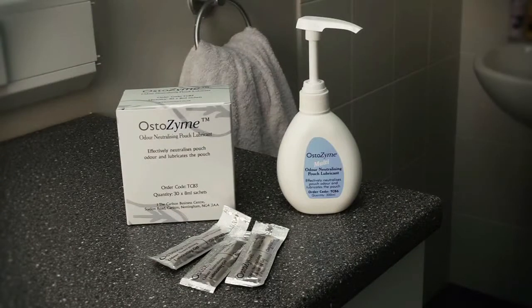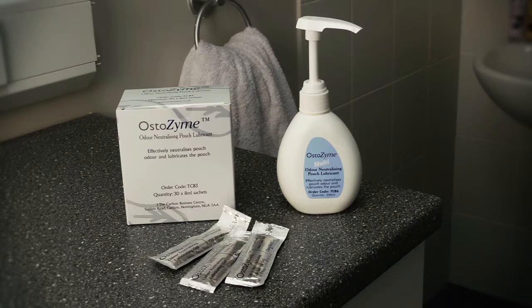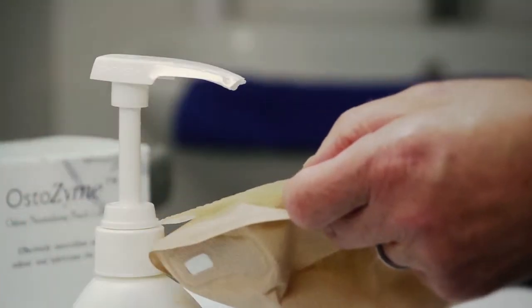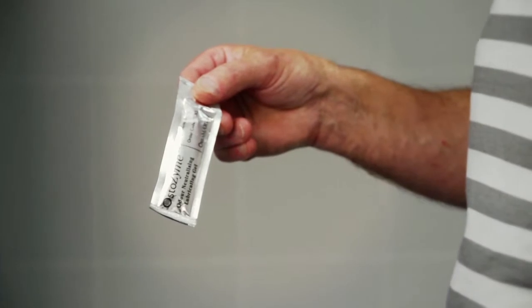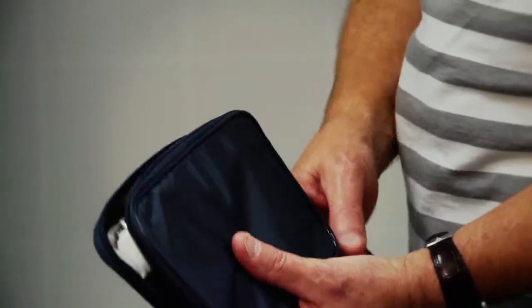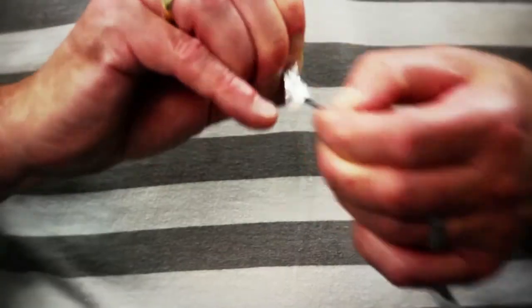Osterzyme is available as either a 300ml pump bottle or as 8ml sachets. The pump bottle is easy to operate, downward pressure is all that is needed. Each 8ml sachet dispenses the ideal amount and makes it easy to carry when out or away from home. The tear strip reveals a narrow spout for ease of use.